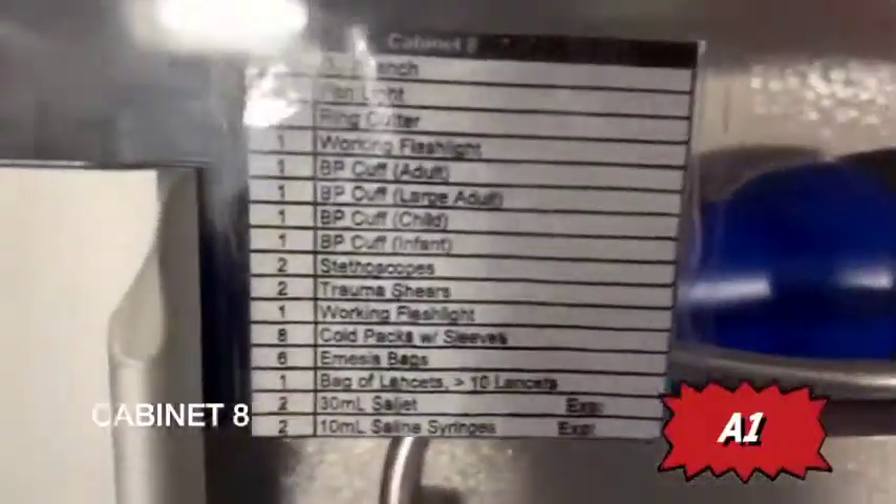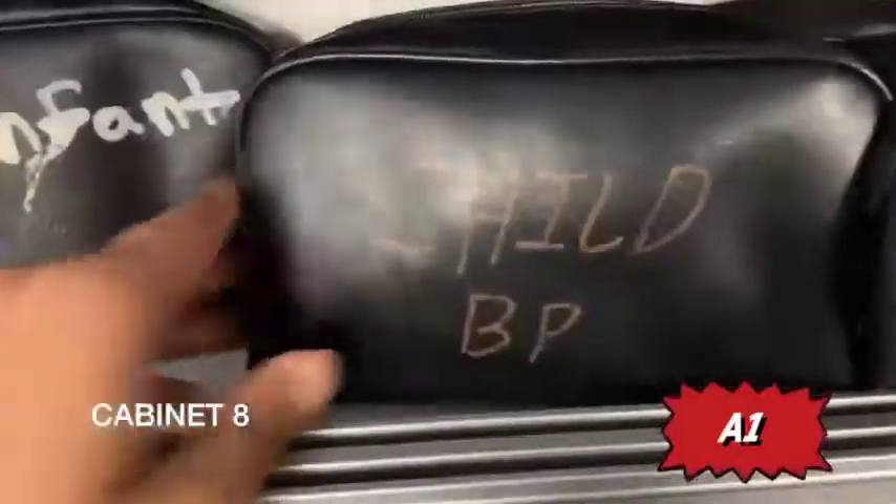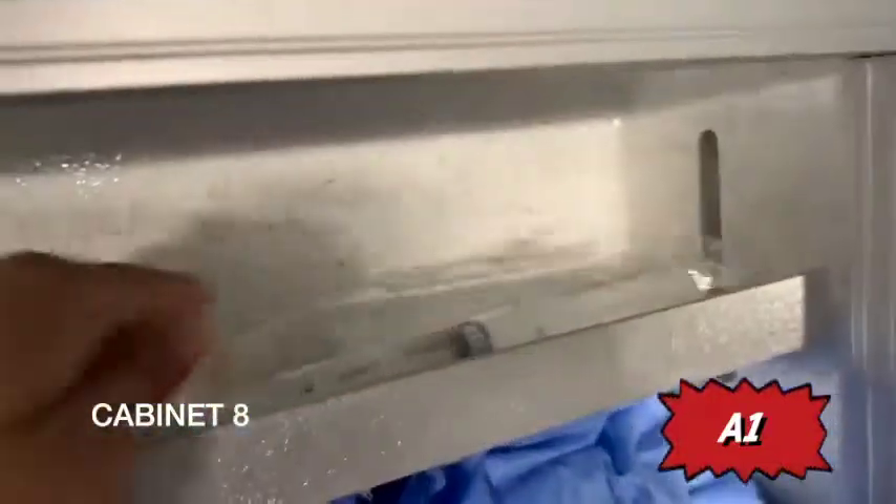Moving on to cabinet eight. When you open it, you have your stethoscope, pen light, flashlight, and emesis bags. You have various sizes of blood pressure cuffs — infant, child, normal, an additional one, and an extra-large BP cuff for large arms. You have lancets, trauma shears, two O2 wrenches, a ring cutter, saline syringes, two cell jets, and eight cold packs.